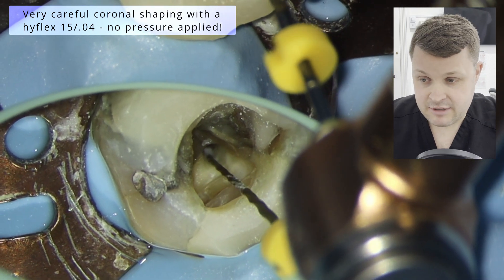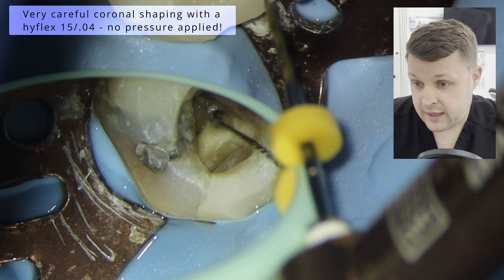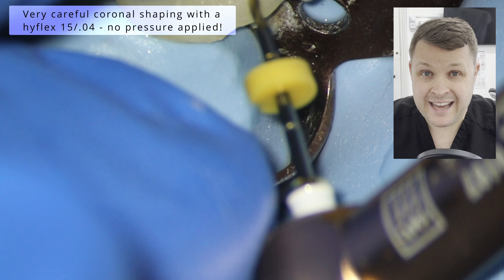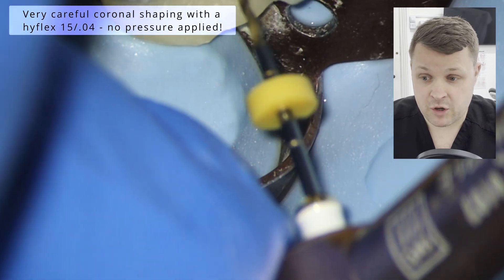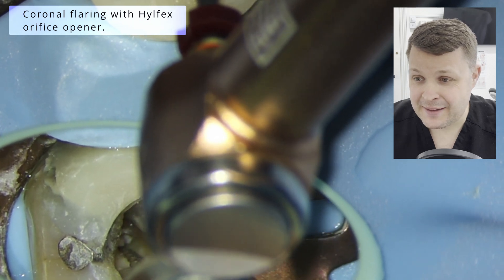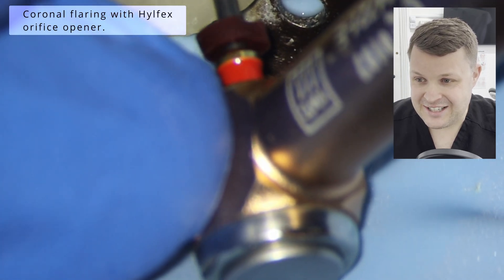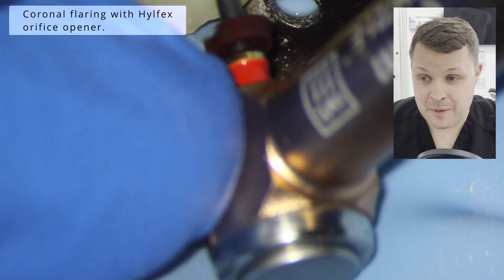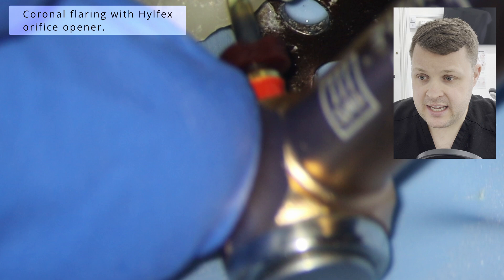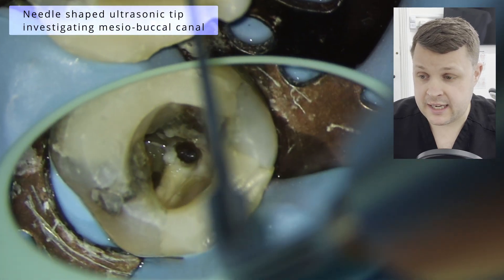So if I'm getting any resistance at all, I'm pulling out and I'm irrigating, and then I'm using a hand file to ensure patency of the canal so far. I seem to be using these RFS openers all the time. I'll be honest — I don't really tend to use the RFS openers too much, but in this case it is highly sclerosed and it just opens up the canal space.